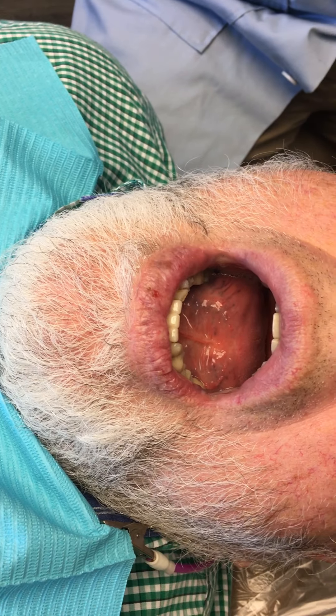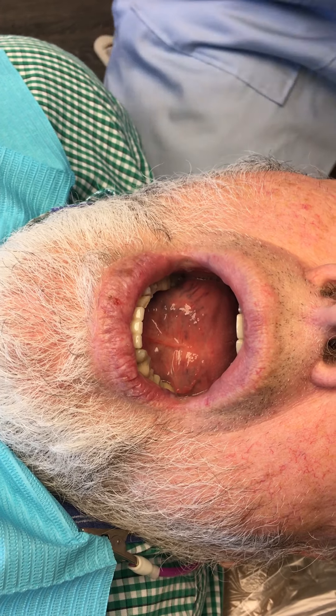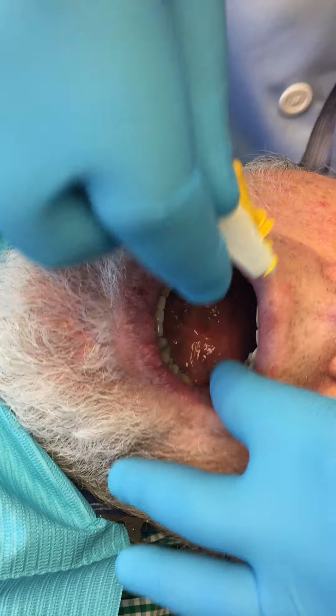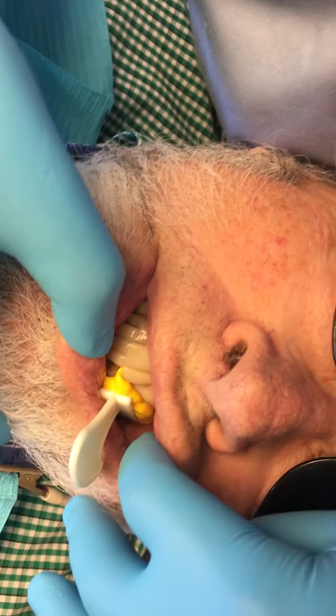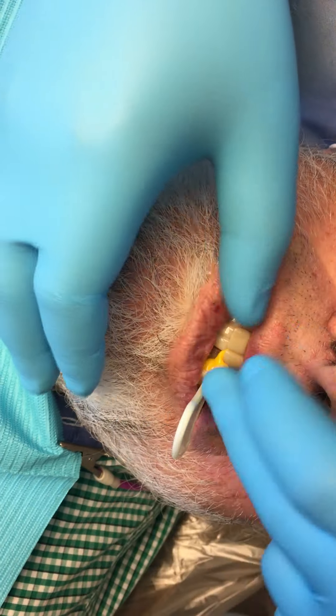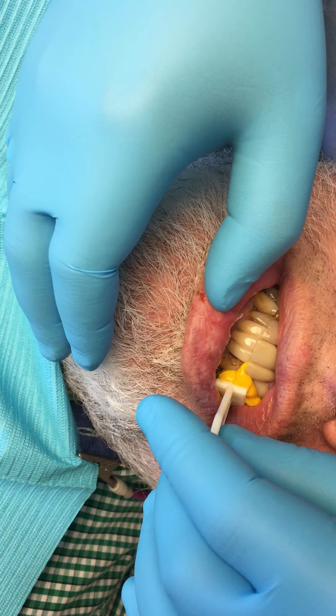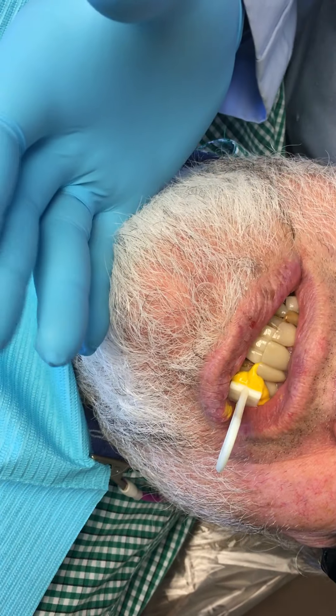This is just a copy of what you have in there, so I have it to make it temporary later. Right down, all the way down. Okay, good — stay just like that. I'll let you know when to open.